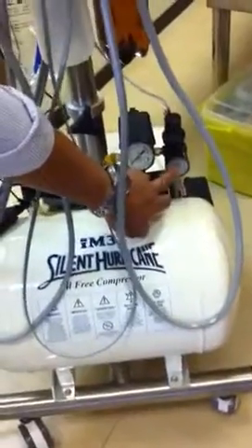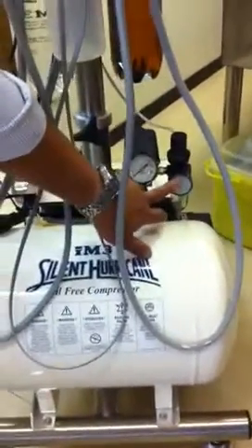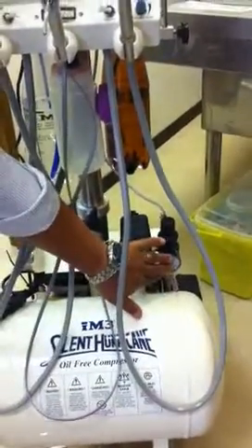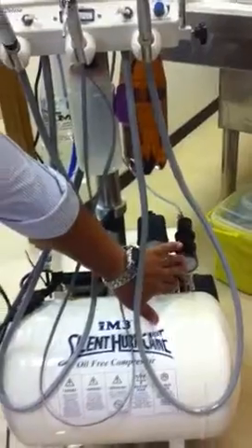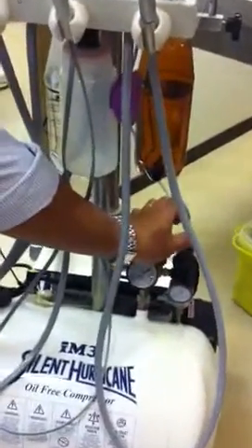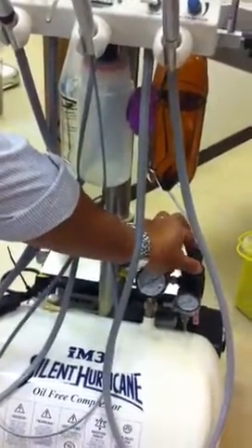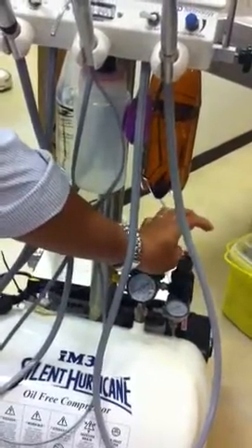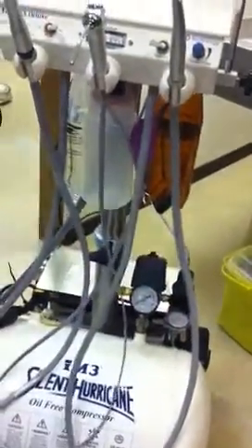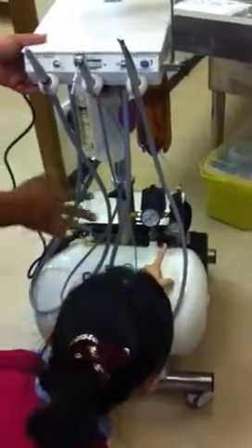This is your low pressure gauge, right? It should be kept between 80 to 90. But this is actually factory preset already. In any case, if you realize that this is out of range, how do you actually adjust the pressure? It's by pulling this knob up and increasing or decreasing. But you don't need to touch it now. Right now it's not pressurized.